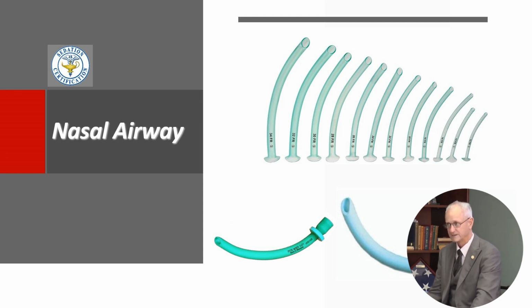Deviated nasal septum. So how do you determine, if you have to use it, and you should do this with every patient, by the way, how do you know you're going to be putting it in the right spot? In the right nare or the left nare? Look at their nose.